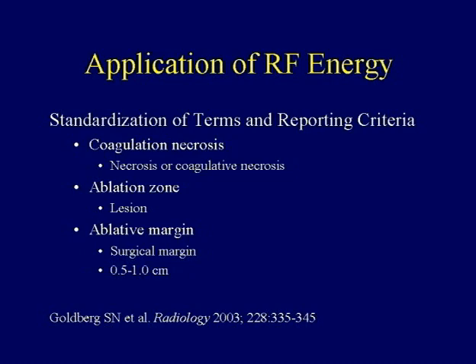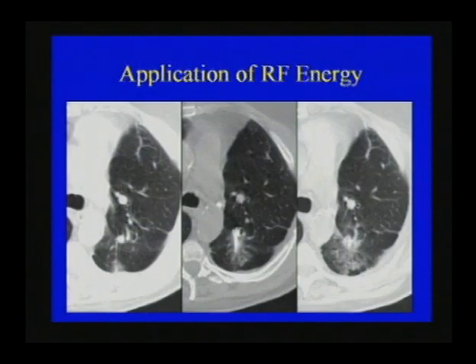In the liver and in other soft tissues, a lot of these techniques can be performed under ultrasound or under MR. Tissue characterization is well done, and you can see the direct effect of the burn, and you want to make sure that there's a half centimeter ring of adjacent zone involved so that you think you've got a good burn. In the lung, we don't have that kind of tissue that we're dealing with. And so what you look for is a ground glass halo to develop around the lesion, and we believe that's the equivalent, although it's never been shown in animal models.